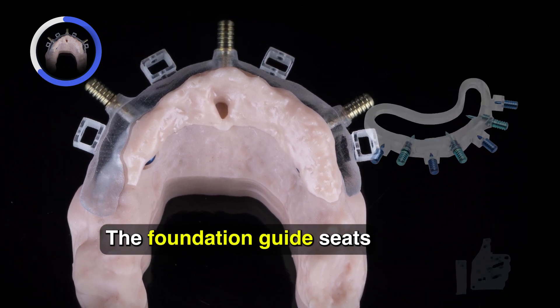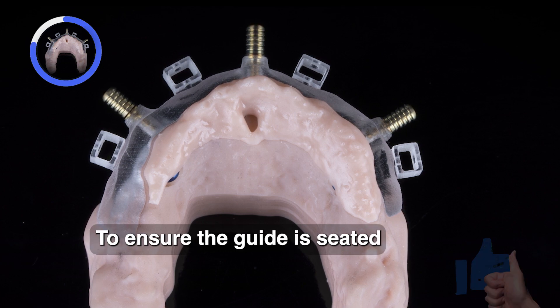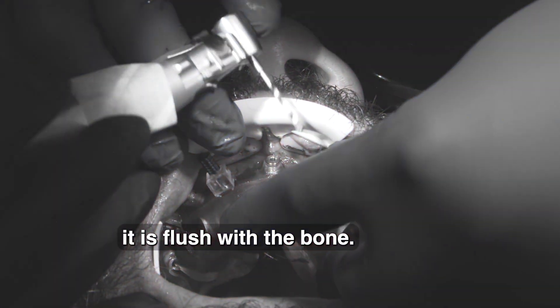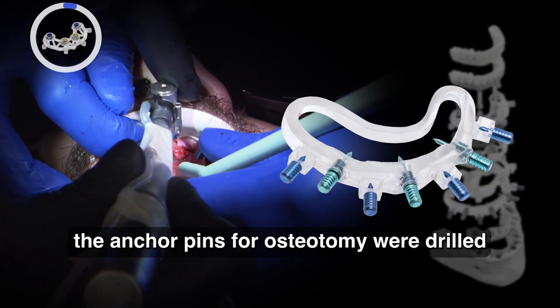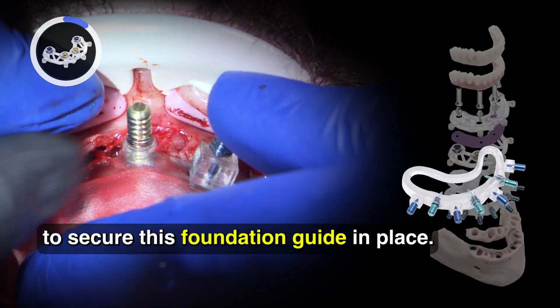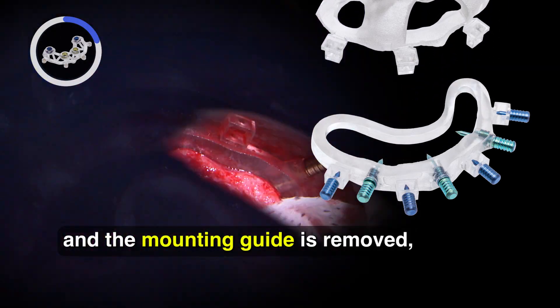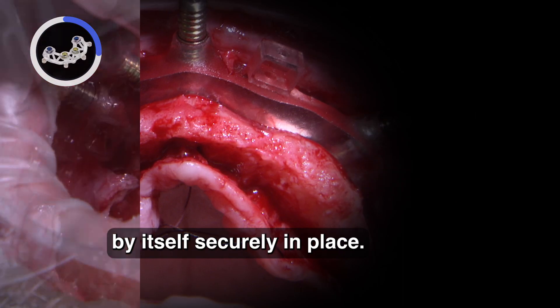The foundation guide seats only on the buccal surface. To ensure the guide is seated in the correct position, we utilize the mounting guide to verify the fit by ensuring it is flush with the bone. Once in a stable position, the anchor pin osteotomies were drilled and yellow anchor pins were placed to secure the foundation guide in place. We then remove the blue interlocking pins and the mounting guide is removed, leaving the foundation guide by itself securely in place.